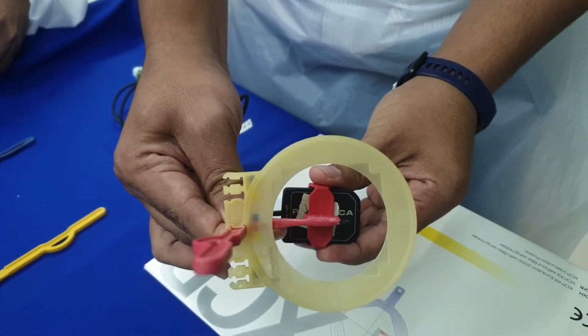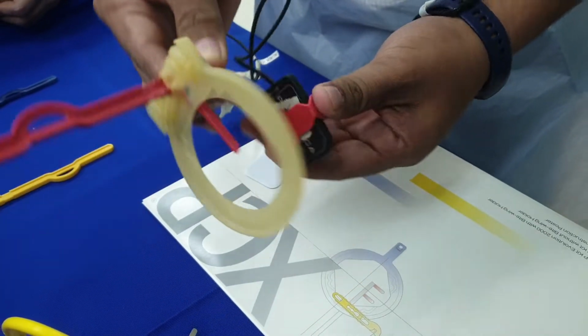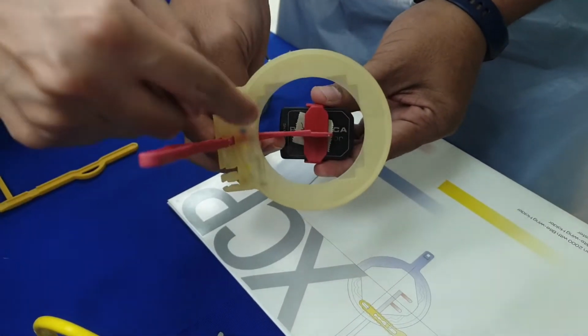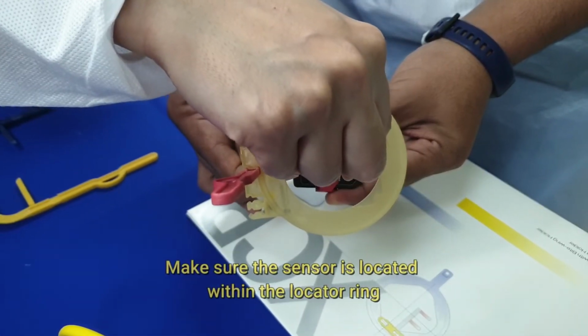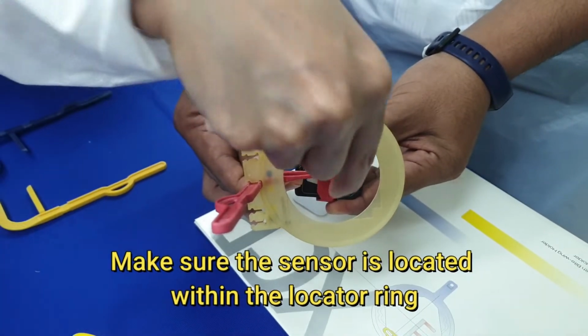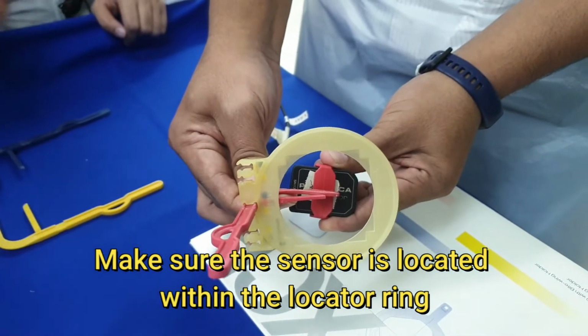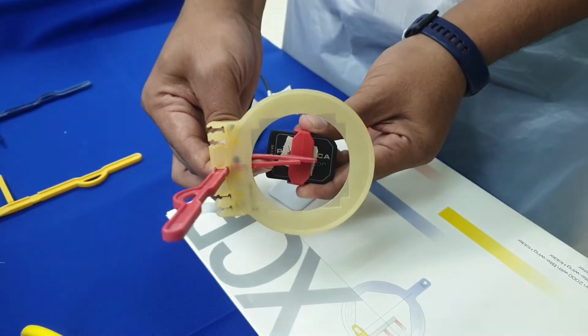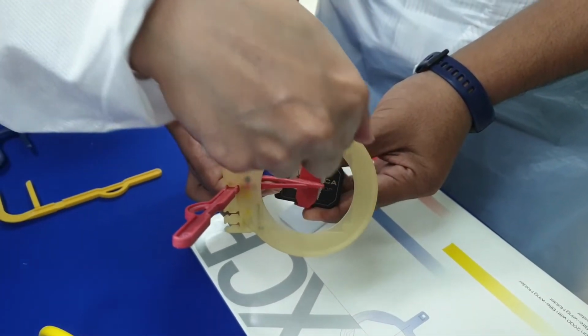Right, again, it's the same concept as the manual X-ray. Make sure the sensor is located within the locator ring. If you see the sensor is not within this diameter, that means something is not right with your assembling. You have to adjust it to make sure that the sensor is within this diameter.